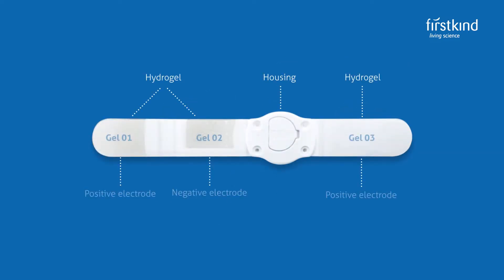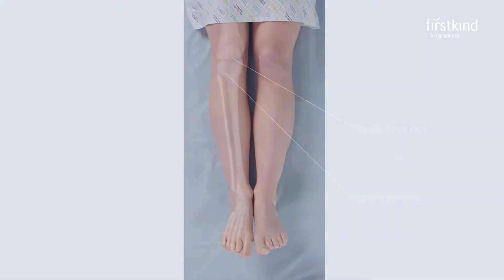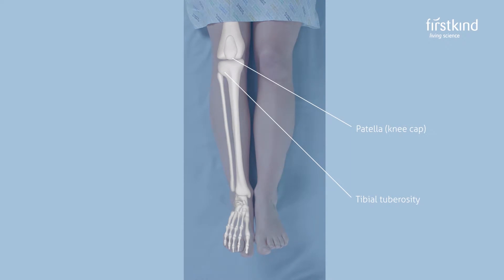On the reverse are three electrodes that make contact to the skin. Before fitting the device, first find the location where the device is to be secured. It can be found on the outside of the leg, just below the level of the knee, at the centre of the fibular head.